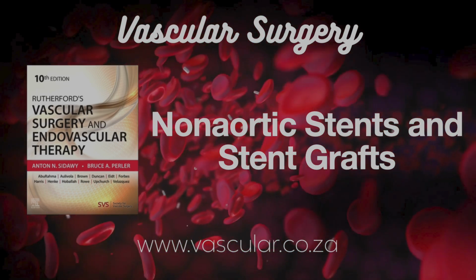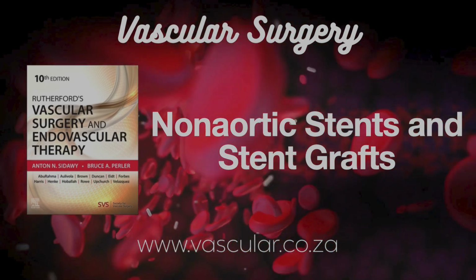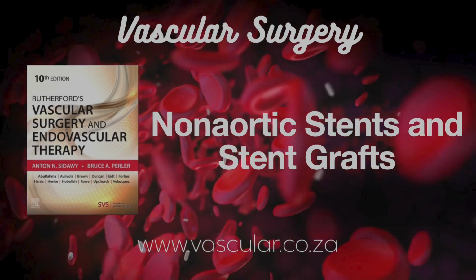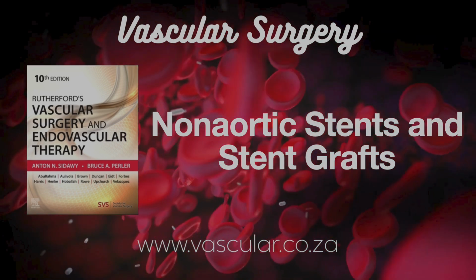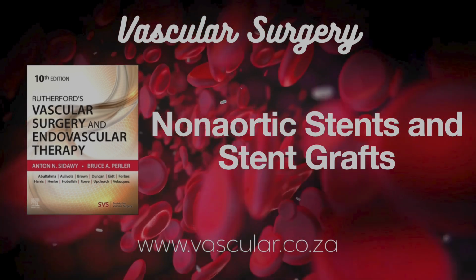Makes sense. Okay, we know how they're chosen, but things can still go wrong. Failure modes. Let's start with a big one. Neointimal hyperplasia and restenosis. Right, that excessive healing response again. The body sees the stent, gets inflamed, smooth muscle cells multiply, and you get this tissue overgrowth, neointimal hyperplasia, that can re-narrow or even block the stent. It's the body trying to heal but going overboard. Pretty much, it's a constant battle.